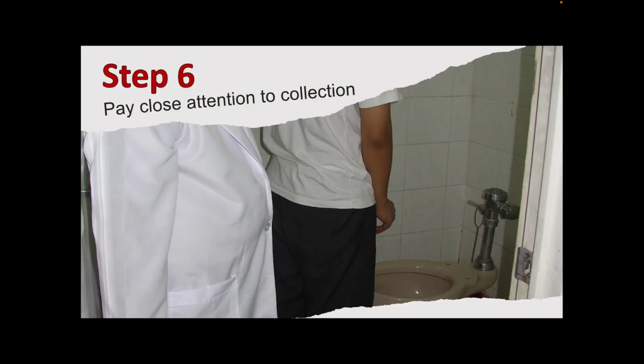And next one, pay close attention to collection and observe one collection at a time. So there should only be the donor and the collector in the collecting area. And when unusual behavior is seen, you have to repeat the procedure as a directly observed collection.